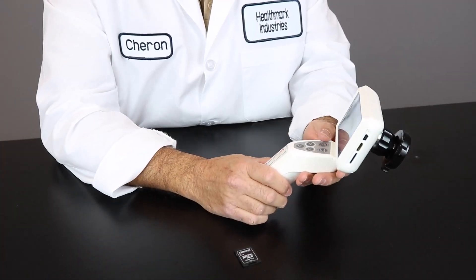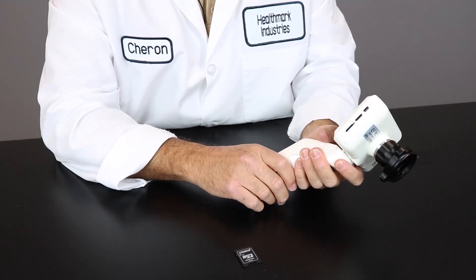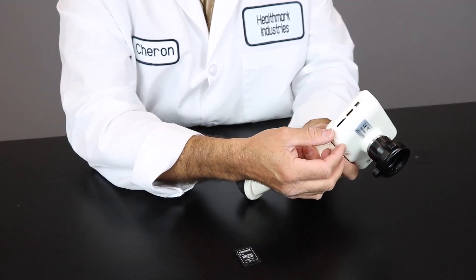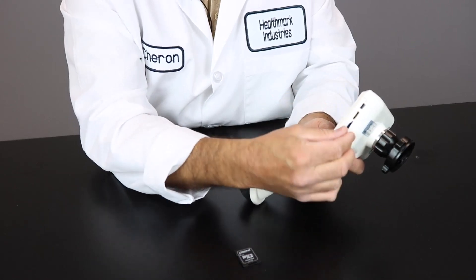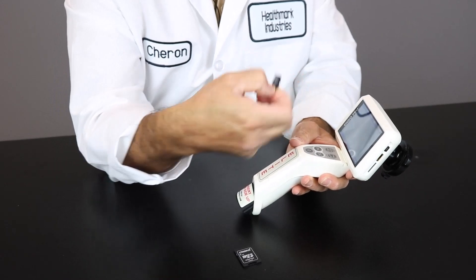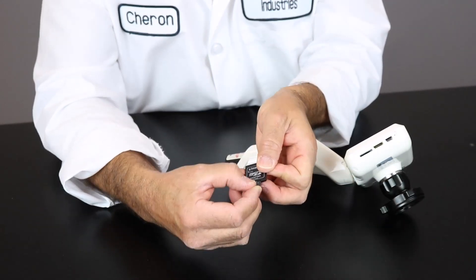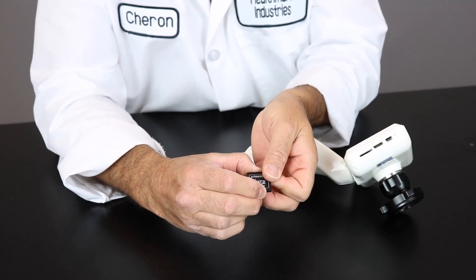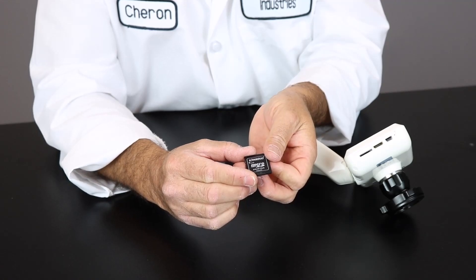You can actually review the pictures and videos that you've taken on the EndoProCam itself. But if you'd like to review those pictures or save them on a different device, you can simply click the micro SD card out and place it in another device, or simply take the micro SD card and place it into the SD adapter. This can be used for certain devices.